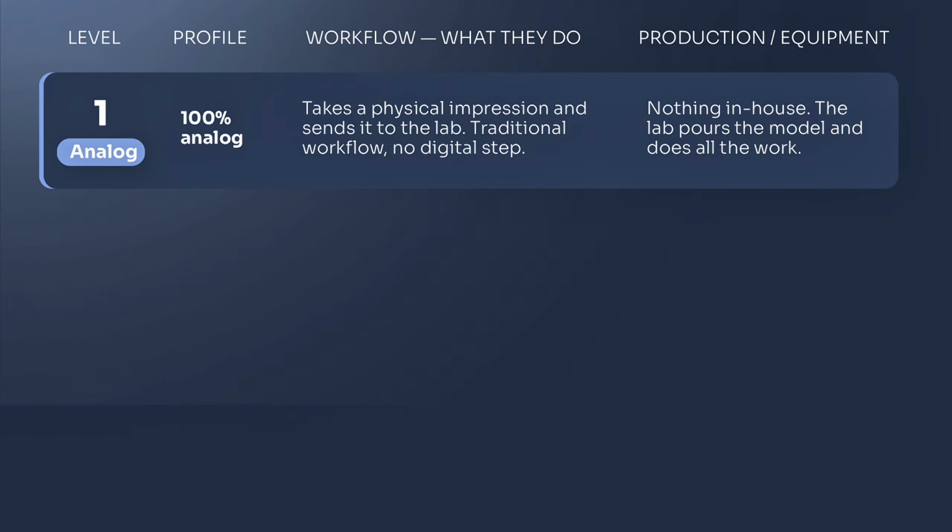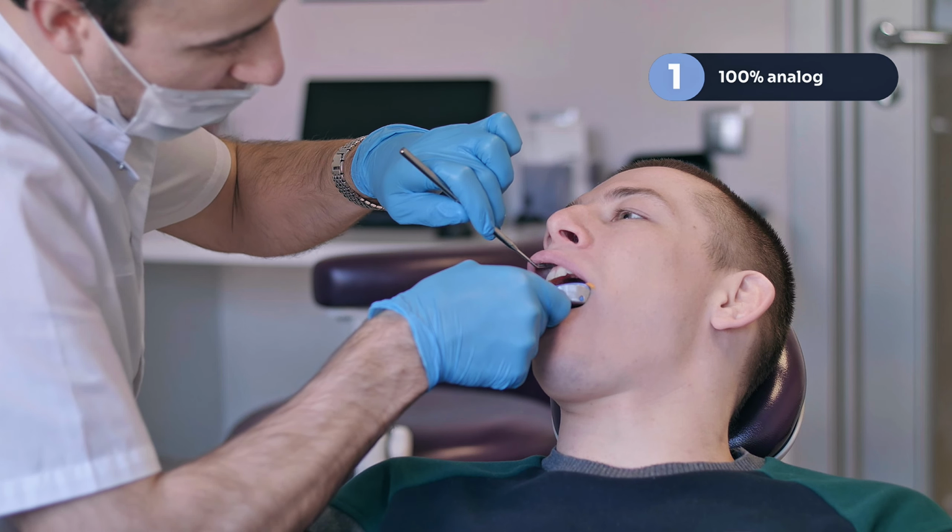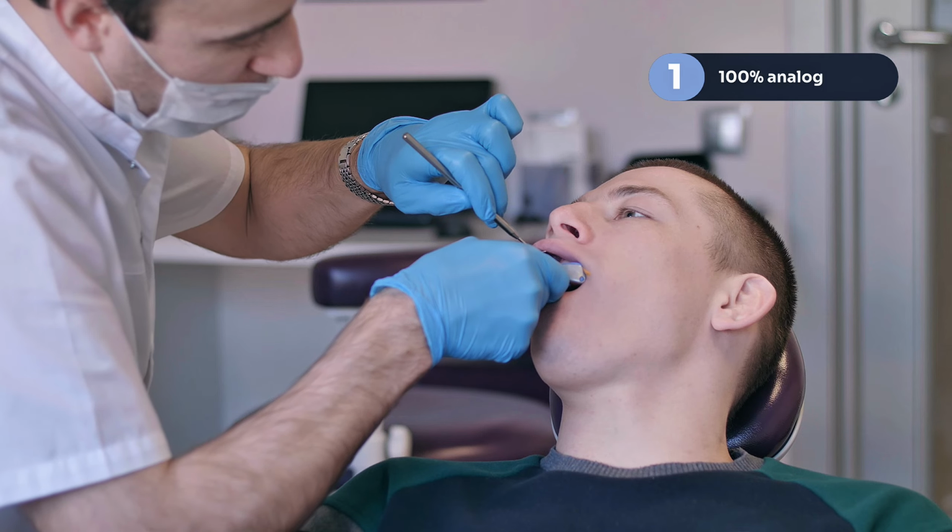Level number 1 is the analog dentist, the one that is still doing the impression, sending it out to the lab, which pours the model, and does the traditional analog workflow. There's nothing wrong with it, but it's not into the digital workflow.